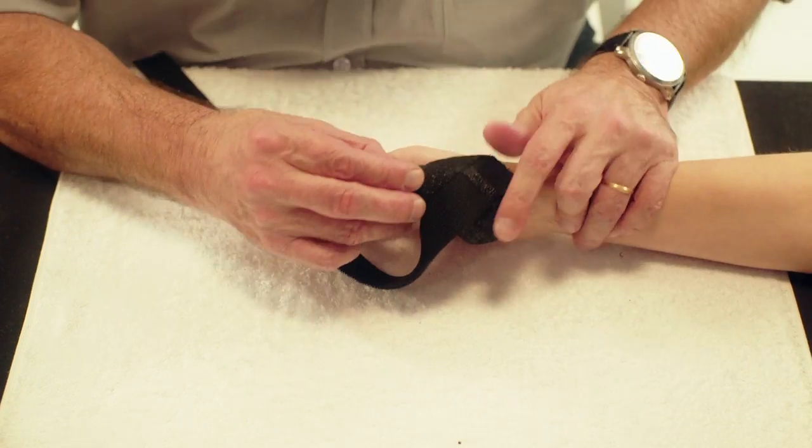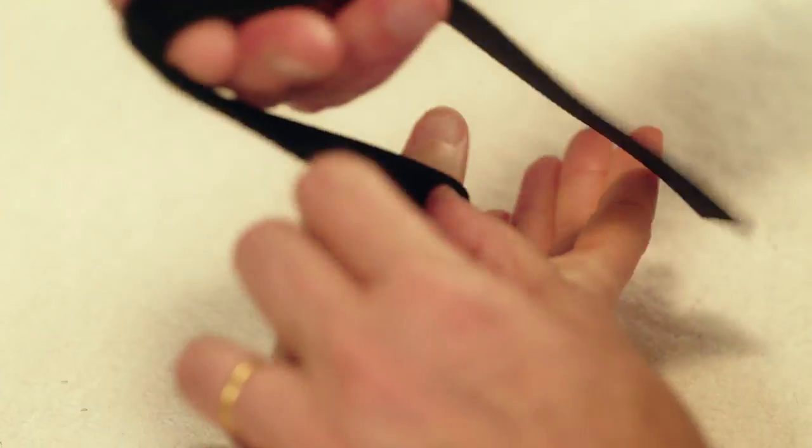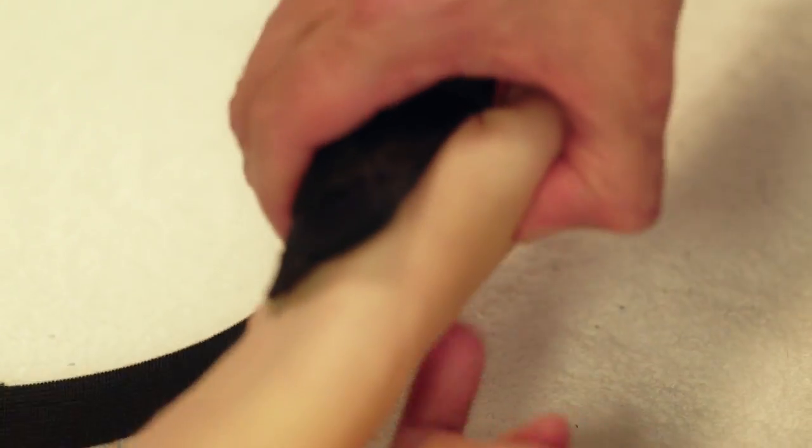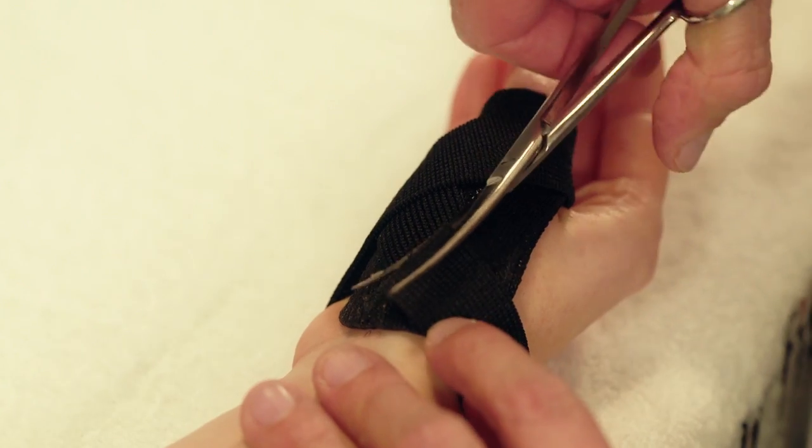Fit the orthosis onto the patient's thumb. Cut away any excess Velcro strap and round the corners.